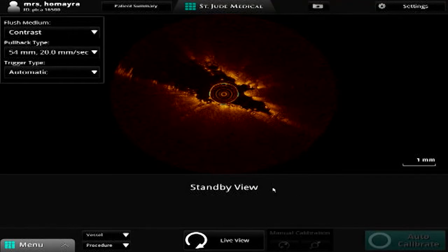Especially in this way, you prevent another metal stent implantation, and you may implant a bioresorbable scaffold which disappears within, let's say, half a year or one year. Yes, exactly, that's what we feel, and so we are passing the OCT catheter right in. When we bring it closer.